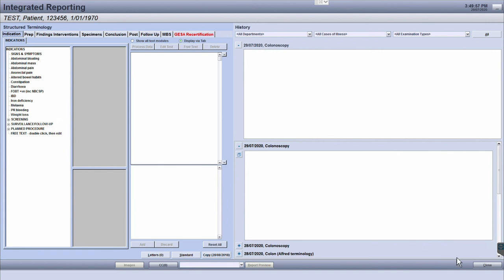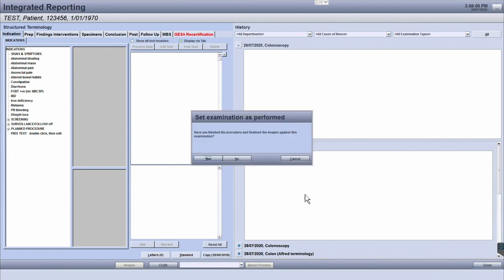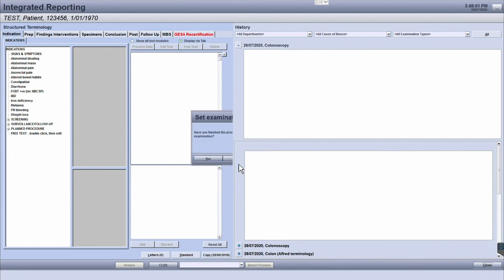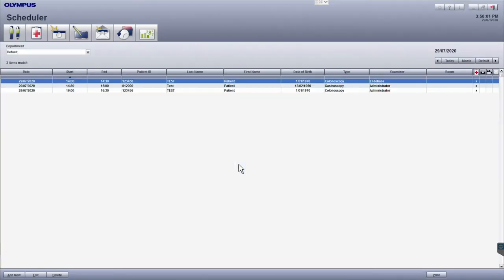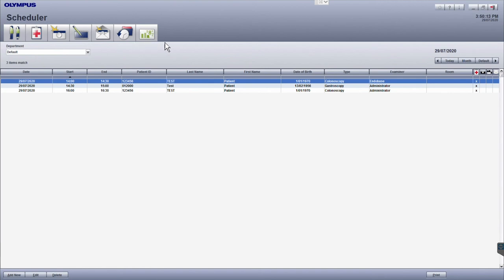Opening and closing each of these modules will return you back to the scheduler screen. The other two icons are the patient history module and the statistics module, which are not part of the routine workflow, but they can be accessed as required.